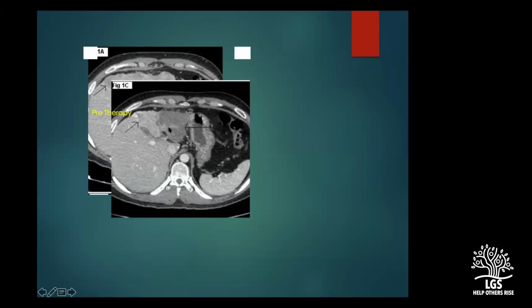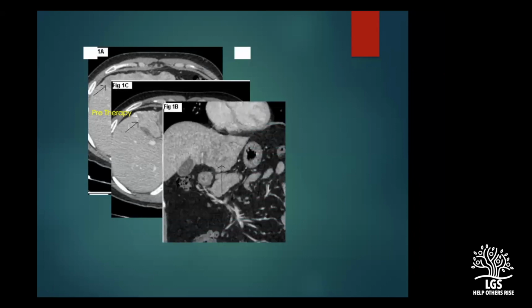So this is a radiation lobectomy that can be offered for patients, especially if they are young patients. You can beautifully take out the entire lobe. It's pretty much a lobectomy. So this is what happens in TARE. So it is an excellent treatment for diffuse HCCs.